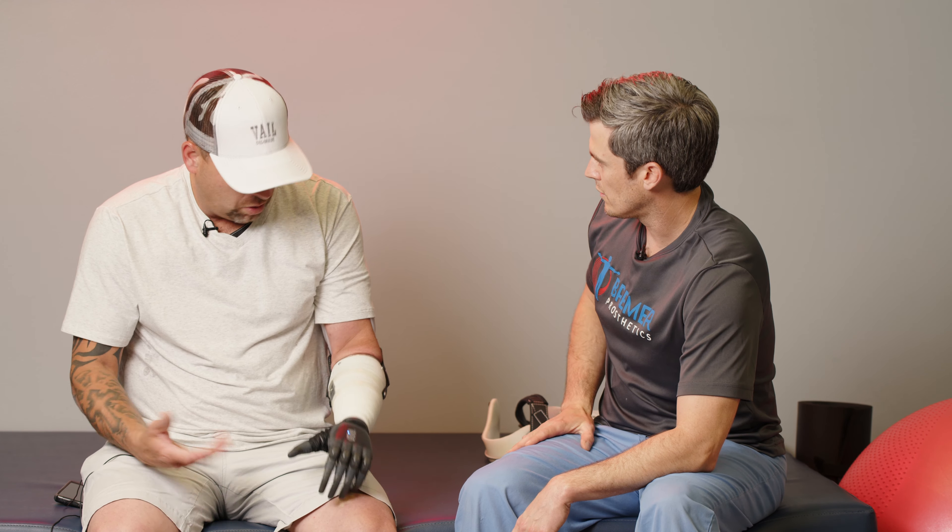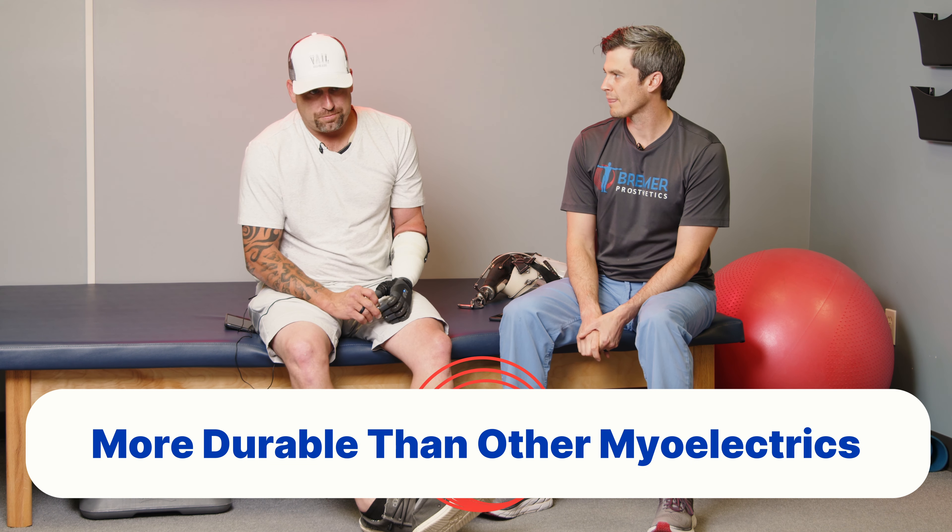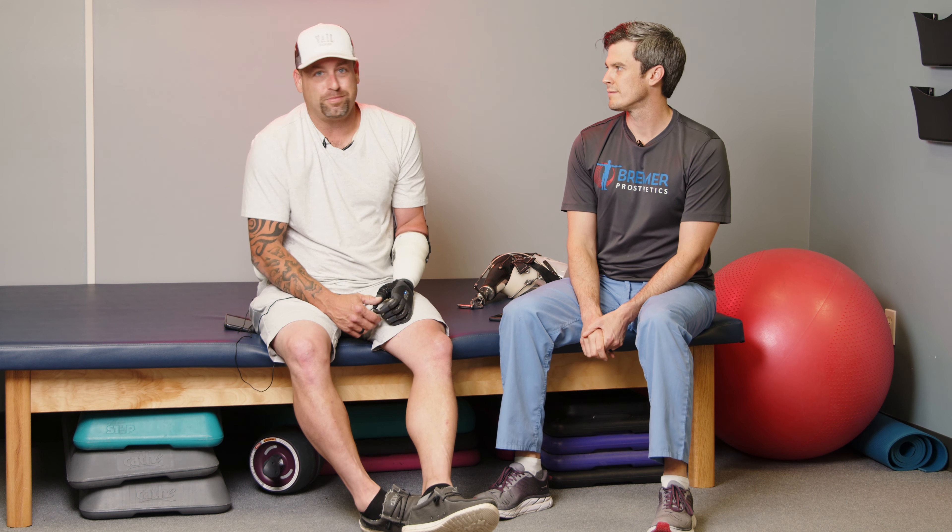How's the socket feel? Good, yeah. That's not a big deal. I've tried using some of my battery powered stuff in the past and it just wasn't built for much.